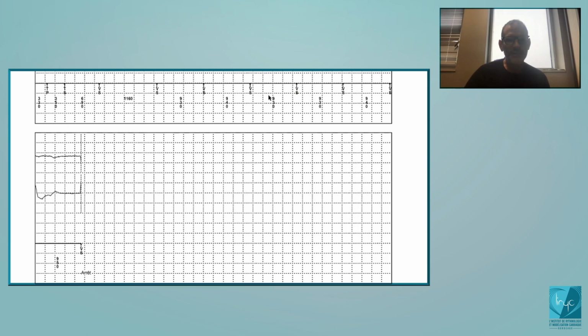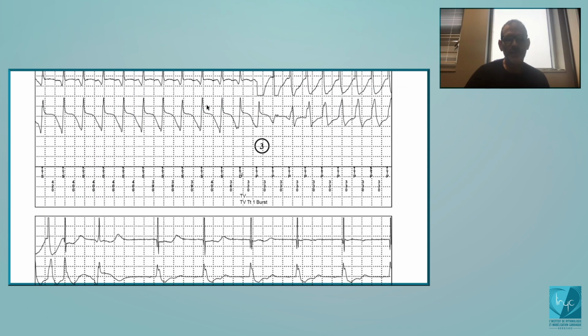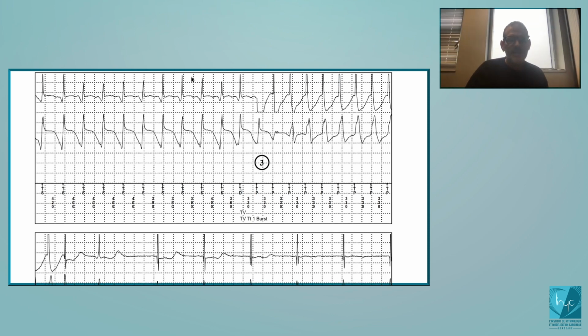In an arrhythmia, sometimes it's not that it is really irregular. You see it's pretty irregular here, but it's the time of the sensing of the signals. When you breathe, in some patients, the same signal in a very stable tachycardia can be detected quite early or later, and it may create problems with the criterion of stability. Okay, so that's for the single lead ICD. If there are any questions, do not hesitate.